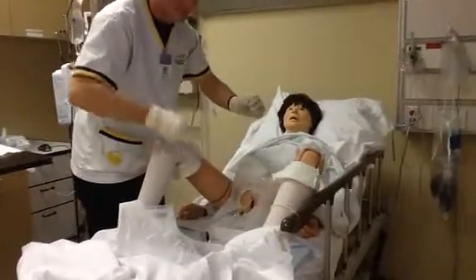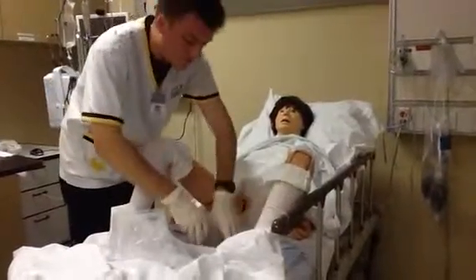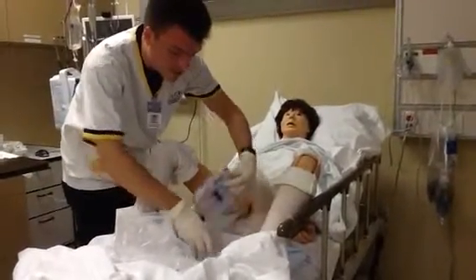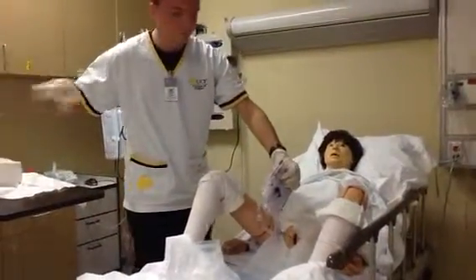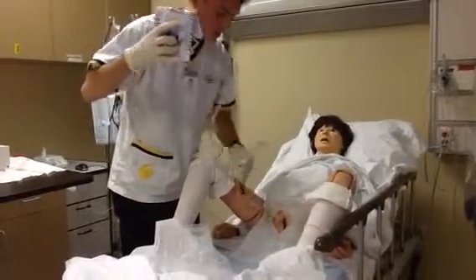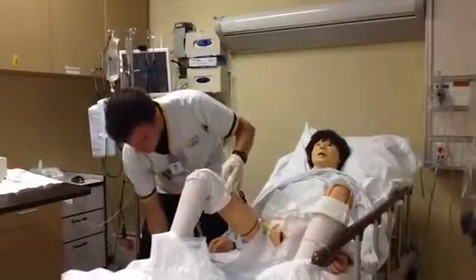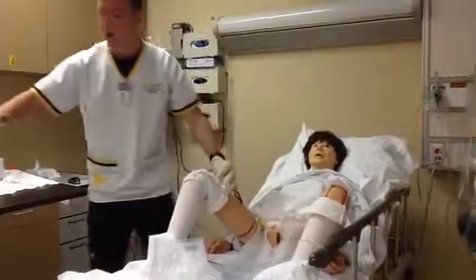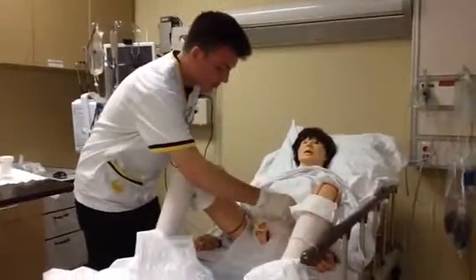Take that off. This is ready to go. And at this time my sterile procedure is finished. The catheter is inserted. The balloon has been blown up. I can attach it securely to the leg here, dangle it off the side of the bed, and if I needed to collect a specimen, I have my specimen container.